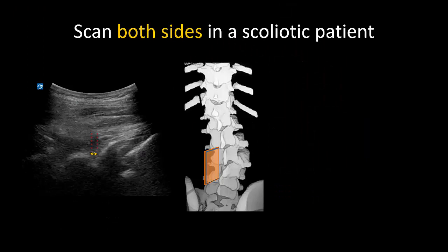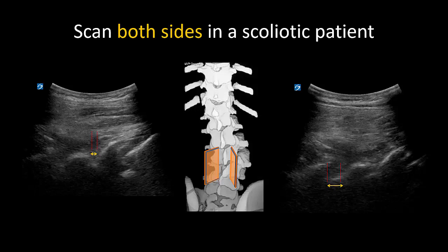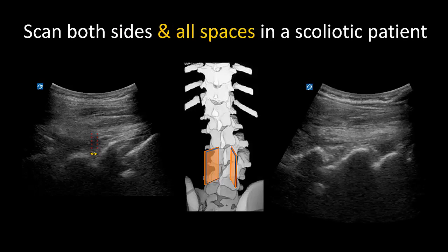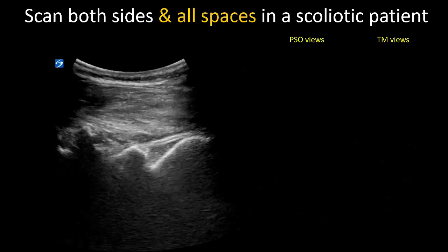A parasagittal oblique scan should be done on both sides of the spine. This will usually reveal narrower spaces on the concave side and wider spaces on the convex side. The width of the space is indicated by the gap between adjacent laminae and also how easy it is to visualize the anterior complex. This gives further clues about the presence of a scoliosis and which way the curves might be going. It is important to assess all the spaces from L2-3 down to L5-S1, as one interlaminar space may be wider than the others.